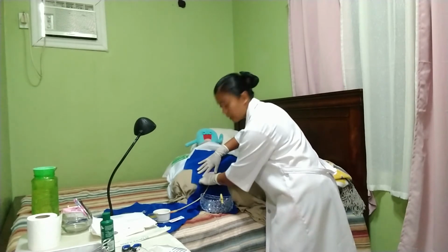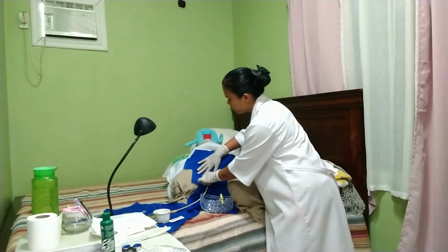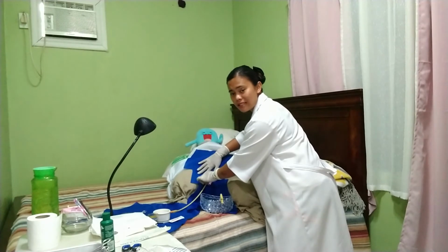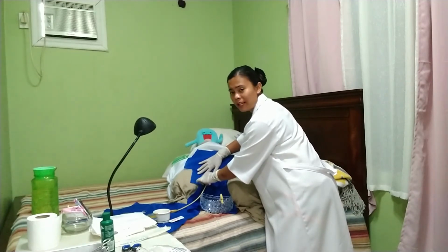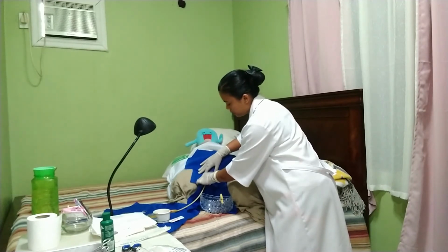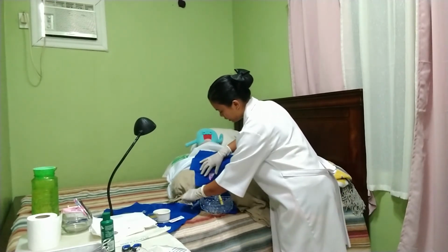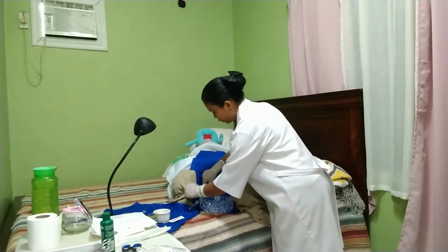Deep breath, very good. Now we have to continue inserting the catheter 2 to 3 inches more or until the urine would start to flow. Now we may feel a slight resistance of the sphincter. What we can do is to twist the catheter gently or apply a gentle pressure, but do not ever force against resistance to avoid damaging the mucosa of our patient. Now that we have reached the desired distance, the next thing to do is to clamp the drainage port to avoid the urine from overflowing.